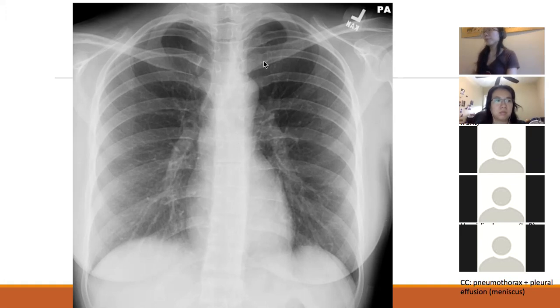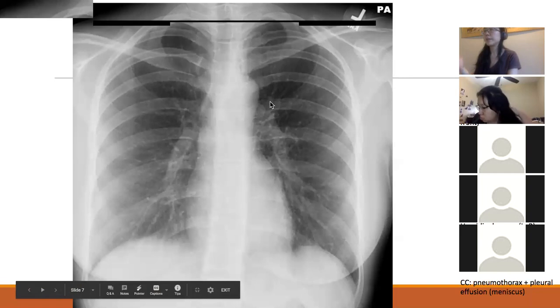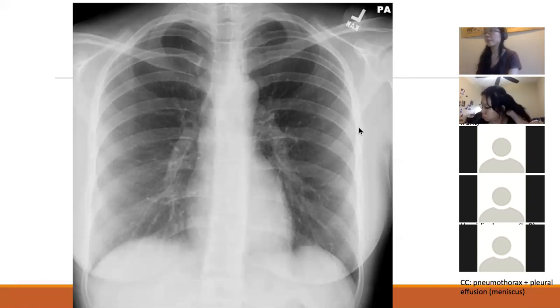Oh, so on the ribs, you might see these nodules on the ribs themselves. Those widened nodules are because your body is trying to grow, right? So you have chondrocytes that are proliferating, but there's not enough vitamin D to fasten down calcium and turn them into real bone. So you have these widened bead-like structures on your ribs that are due to the lack of vitamin D, and that would be rickets.